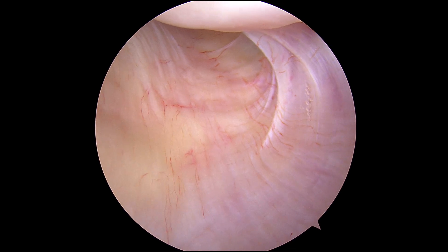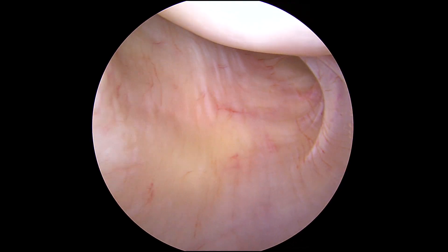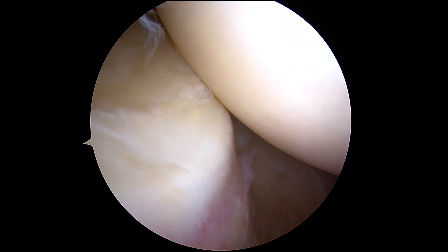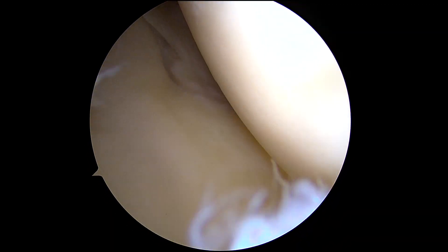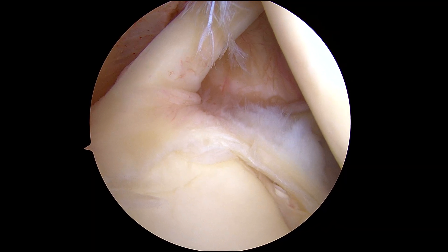The inferior glenohumeral ligament looks like a wave that's about to break right there — so that's an intact inferior glenohumeral ligament. We come around here, that's the inferior labrum coming back up into the joint. You can also see there that the labral tear extends a little bit into the front over here.